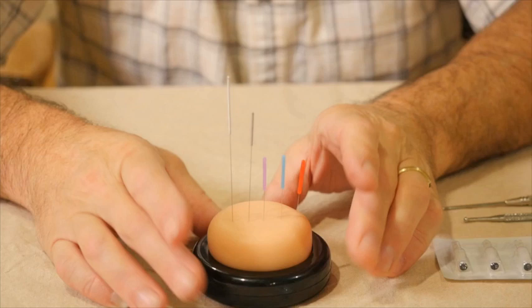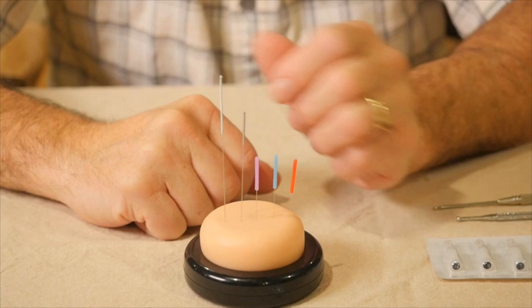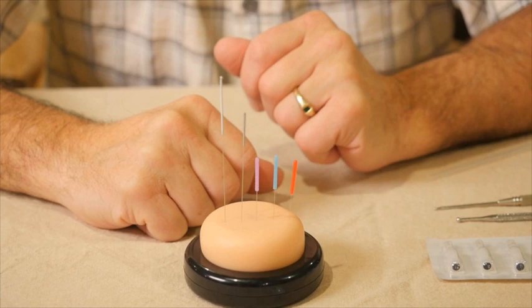Those are your basic acupuncture needles — the standard needles used in standard acupuncture treatments. These needles are generally inserted, left in place for anywhere from a few seconds up to 20 minutes, and then removed.